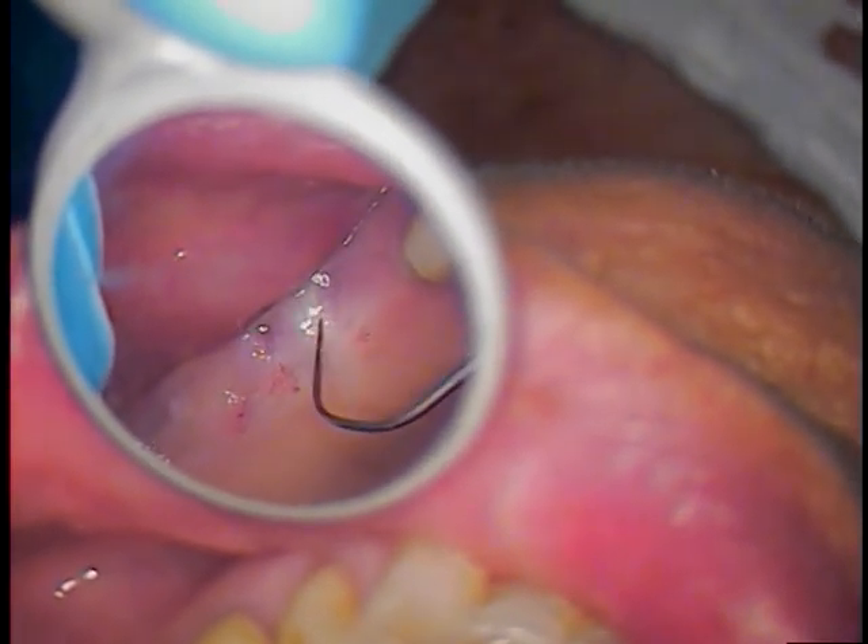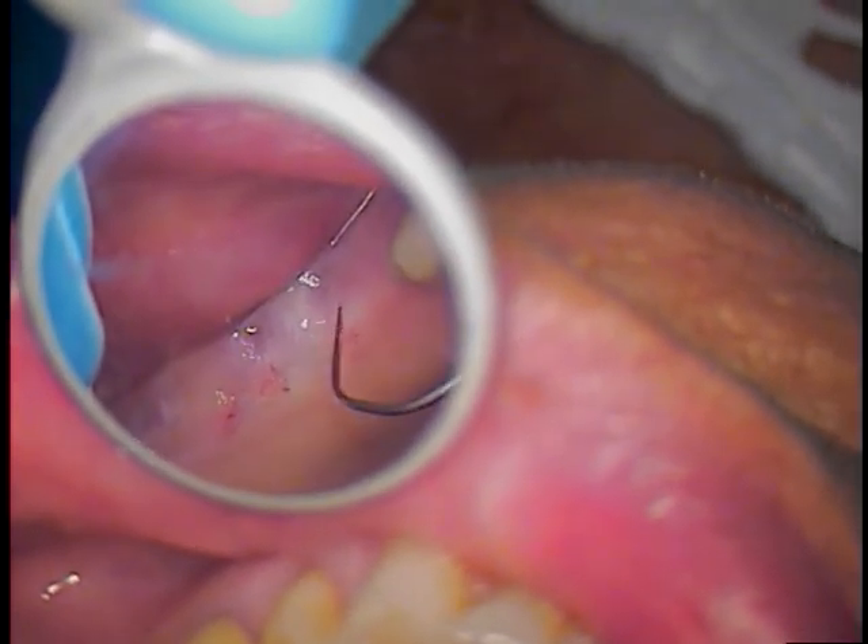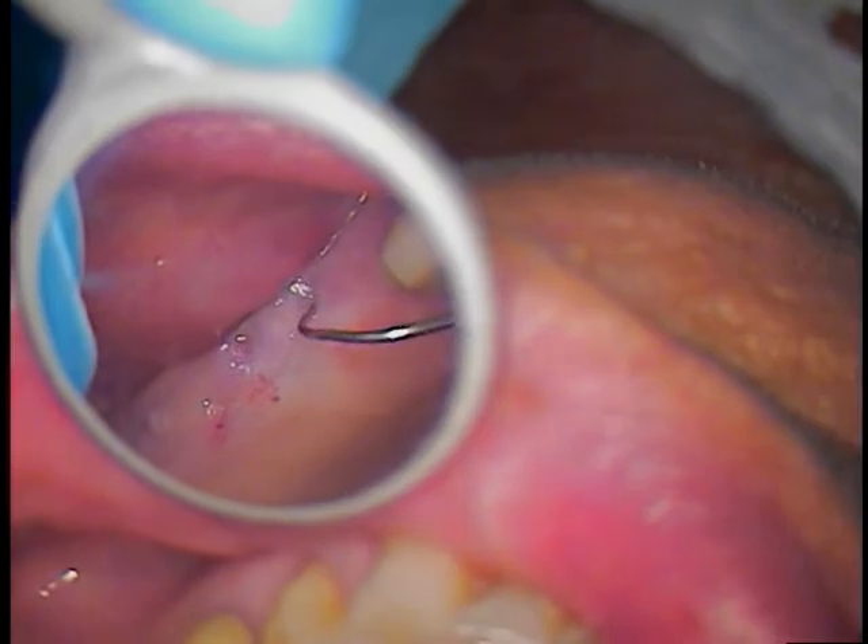We're going to use a little tissue punch. The patient's anesthetized, so we're going to go ahead and tissue punch the first one, clean it up, and hopefully get out that fractured abutment screw.